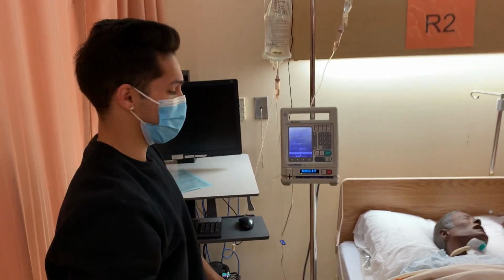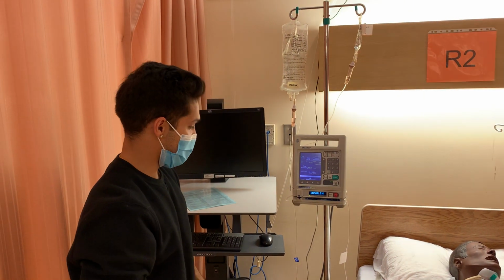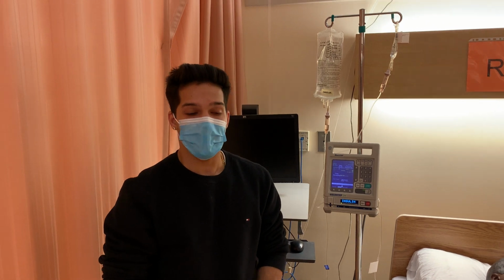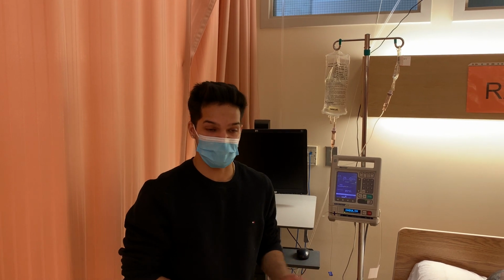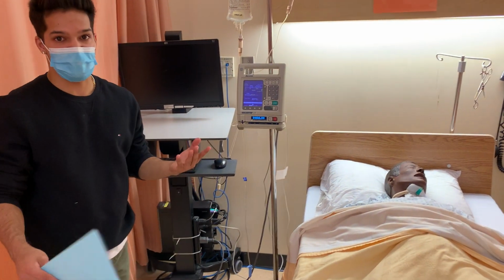Okay, so now I'm going to be leaving the room, and then documenting the date and the time I changed this. I'm also going to be monitoring the patient's blood glucose every hour while I'm doing this infusion. Once their blood glucose gets within the goal range, which is 6 to 10, I'll be monitoring them every 4 hours. And yeah, so now I'm good to go leave the room and document with my second nurse.